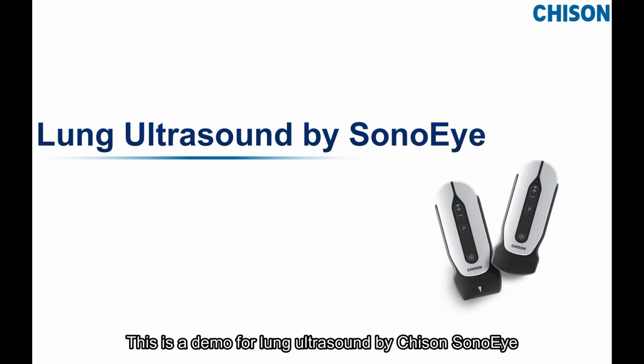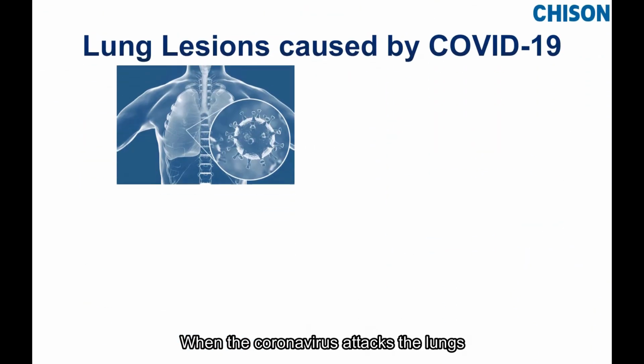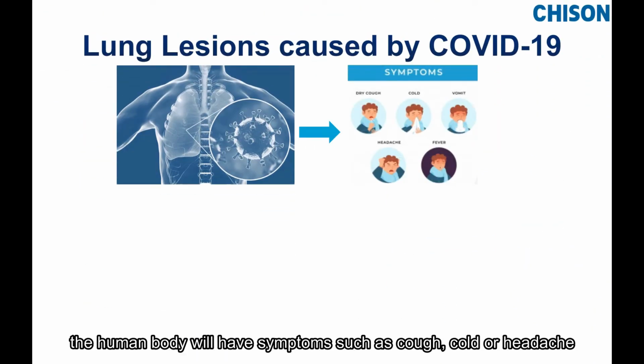This is a demo for lung ultrasound by Chison SonoEye. When the coronavirus attacks the lungs, the human body will have symptoms such as cough, cold, or headache.